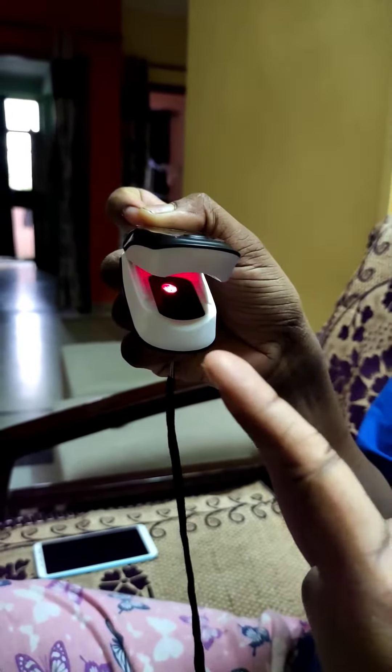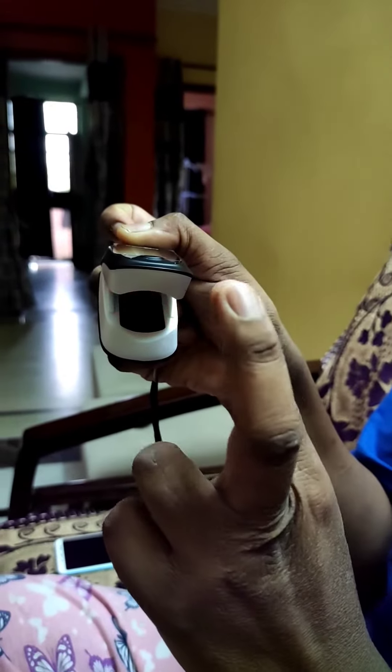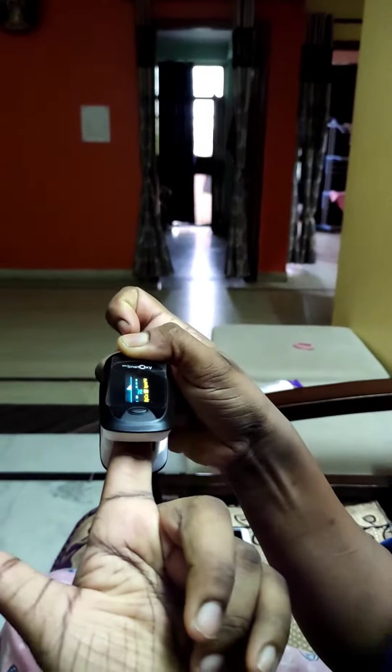You have to place your finger in a way that your nail is just over the red light, like this. Keep it like this.